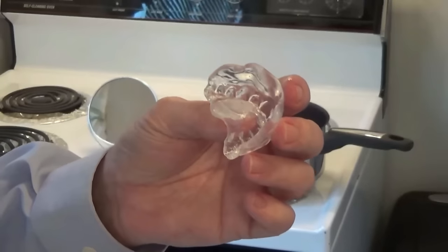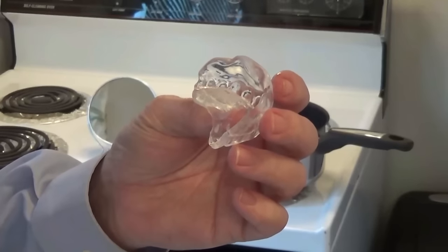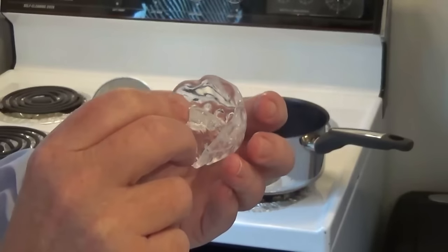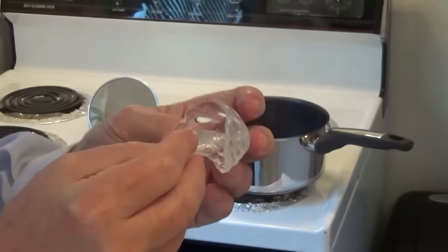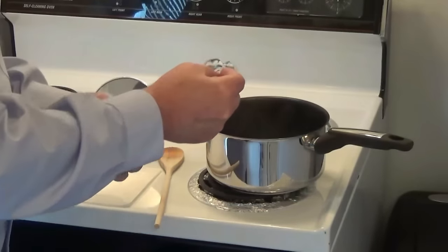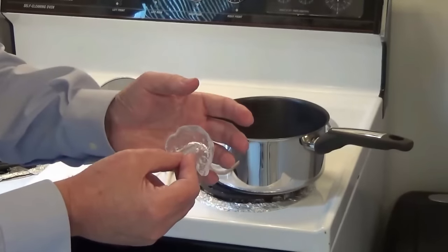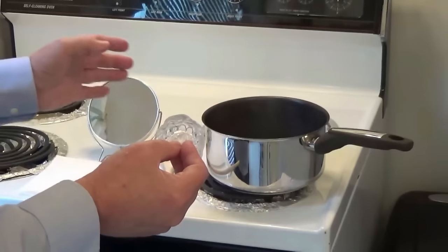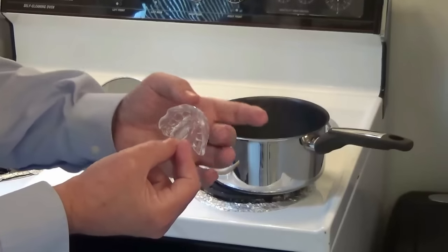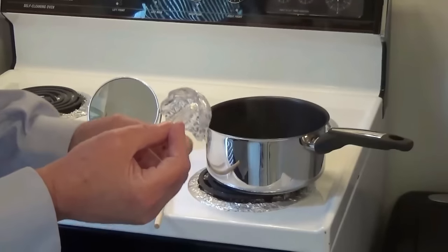Now, if this wasn't a good mold — a nice and tight fit — which means you have to try to kind of peel it off, then what you can do is take this and place it back in the water for approximately five seconds. Just enough to soften the material. Then you want to use your mirror again and push on the sides of your mouth to make sure you get a nice, good, tight fit. And that's all there is to this.